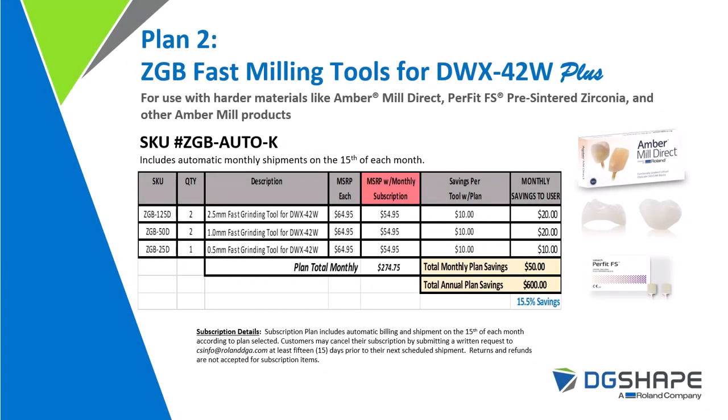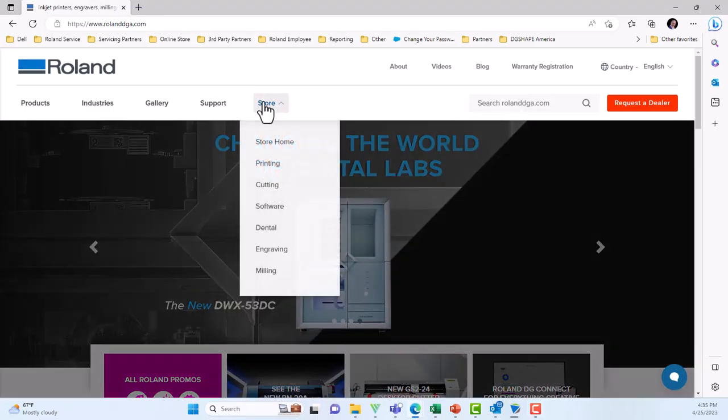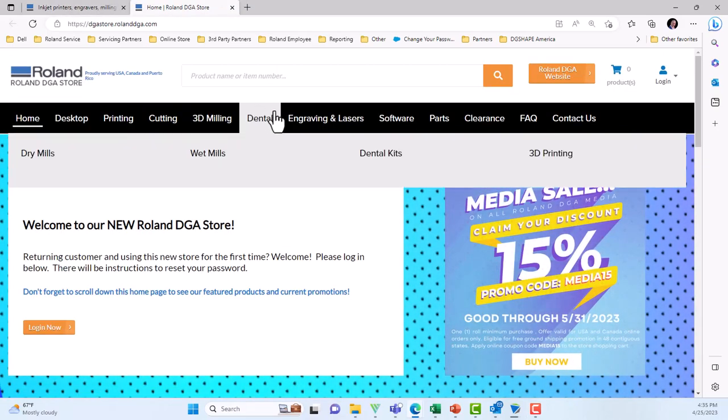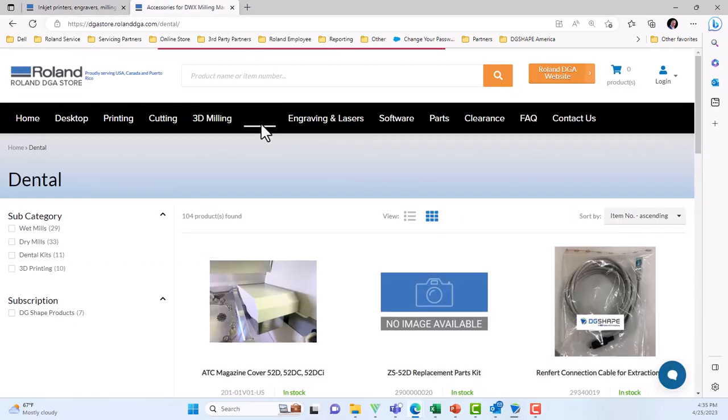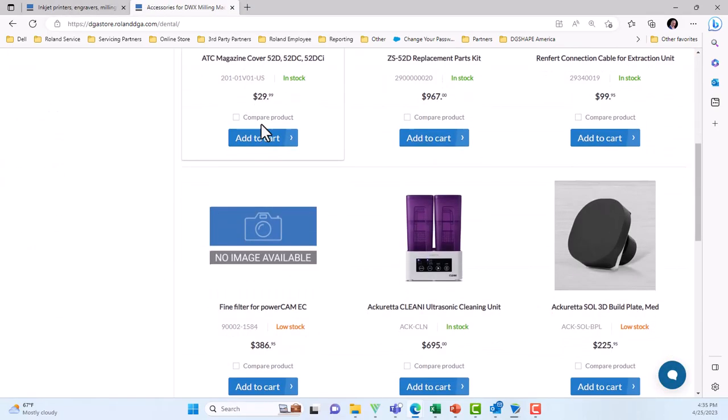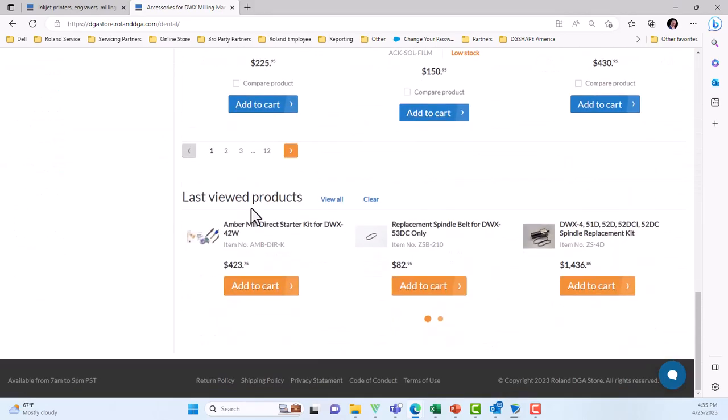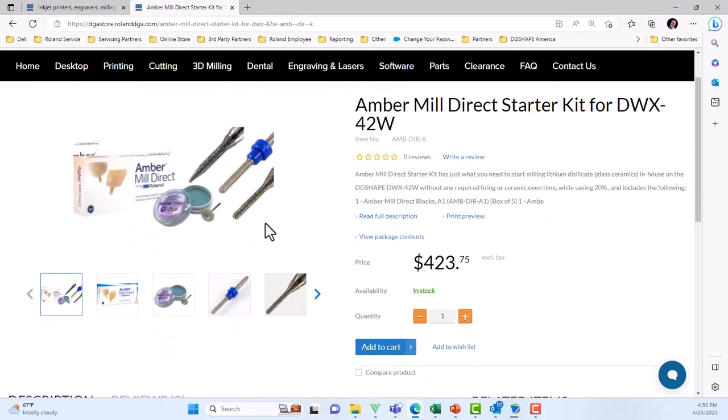Plan II ZGB fast milling tools for the DWX42W Plus. For use with harder materials like Amber Mill Direct, PerFit FS pre-sintered zirconia and other Amber Mill products. With a total annual plan savings of up to $600.